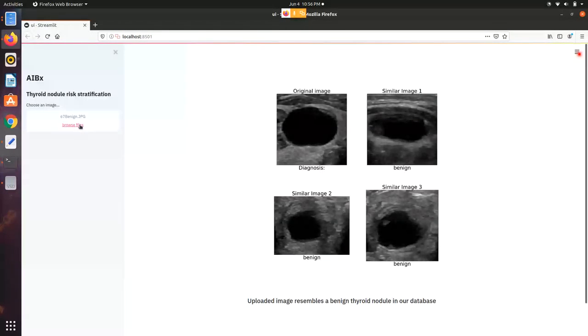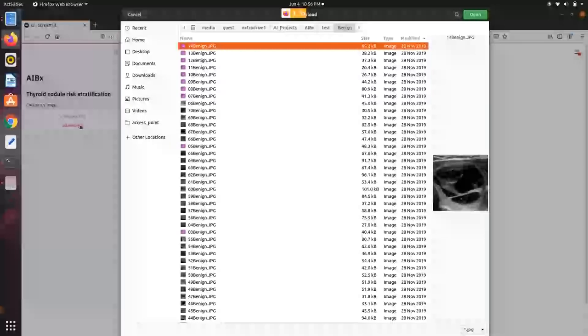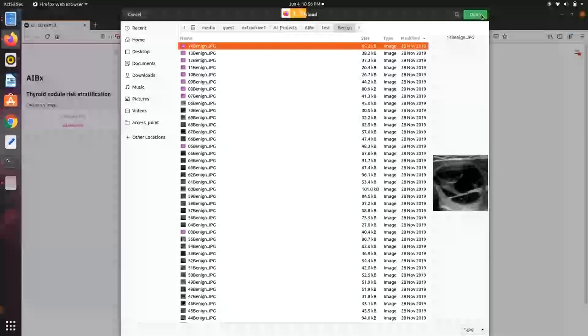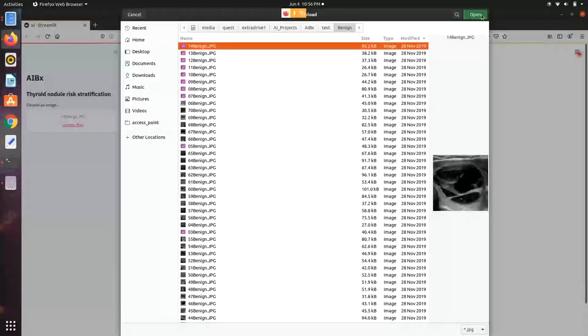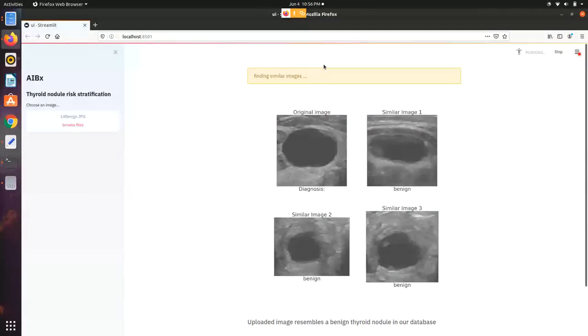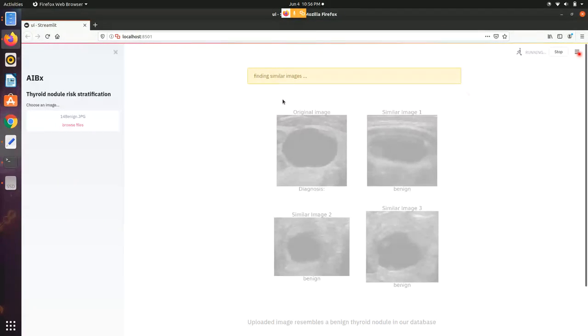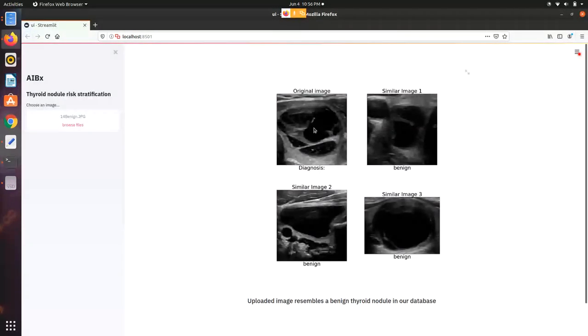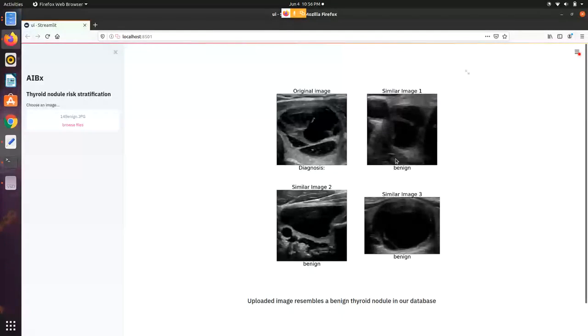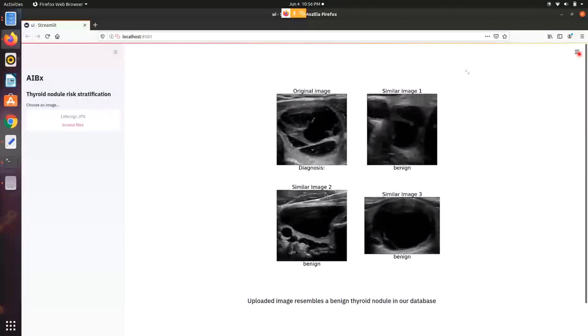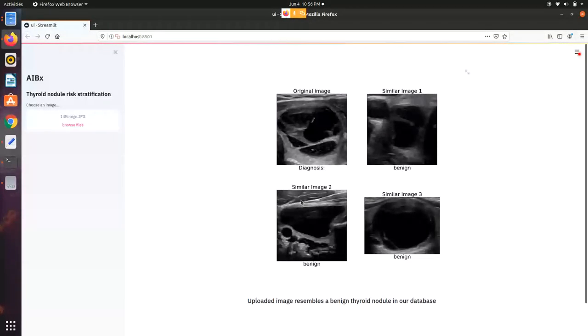Let me show you a demo. I'm going to pull a benign image from the test set. It's finding similar images, give it a few seconds. This is the original image and this is the first similar image and the diagnosis is here. This is the second similar image with the diagnosis, and so on.